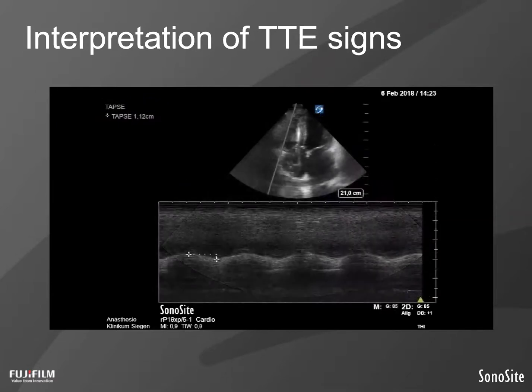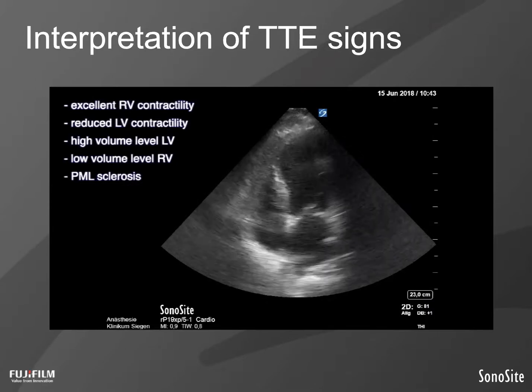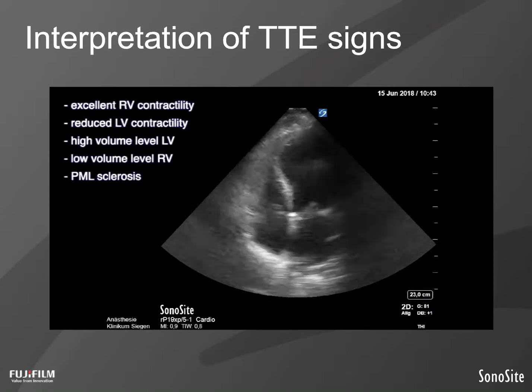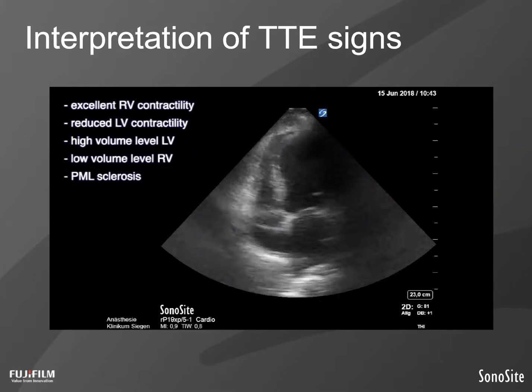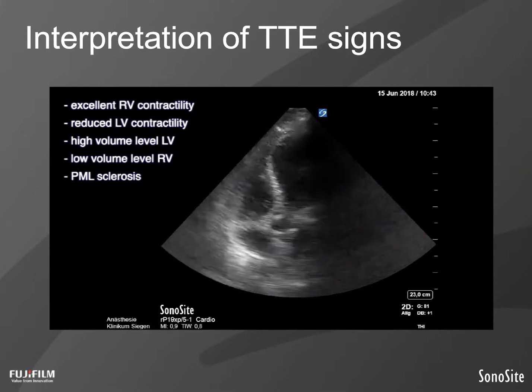But always remember, don't be frustrated if you are not able to get sufficient image quality in every sectional plane, which may impede overall decision making. As you gain more and more experience, you can also assess difficult findings while image quality is worse.